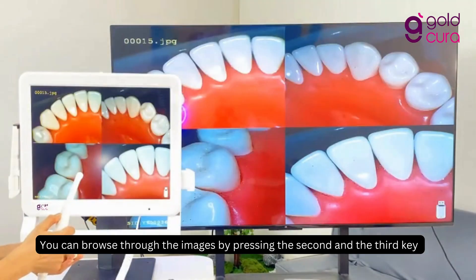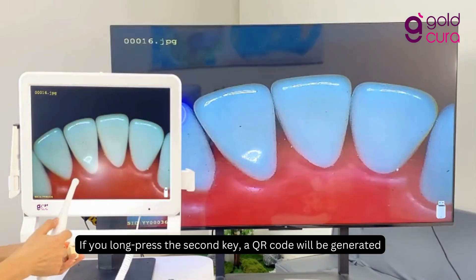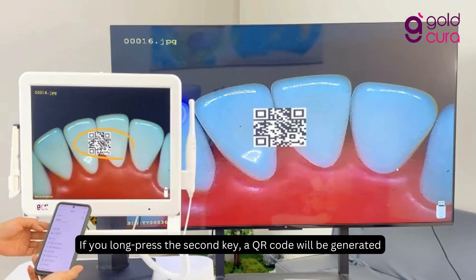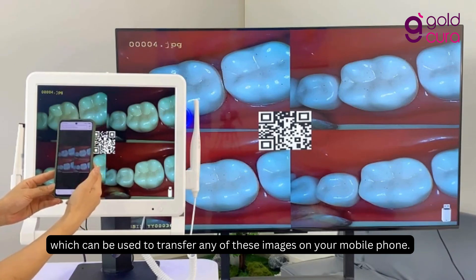You can browse through the images by pressing the second and third key, and if you want to delete any image or video, just long-press the third key. If you long-press the second key, a QR code will be generated, which can be used to transfer any of these images to your mobile phone.